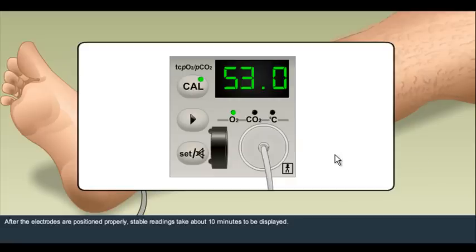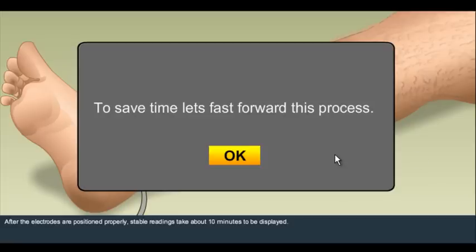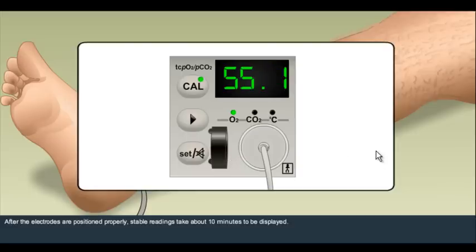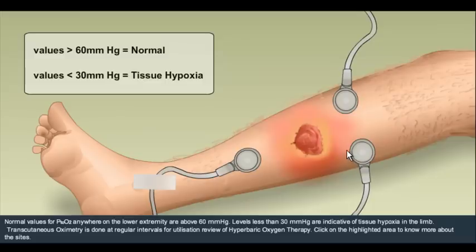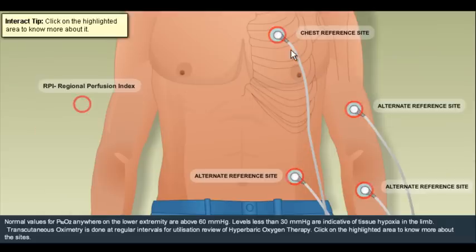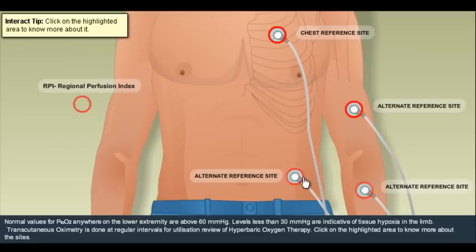See how the TECOM measurement is being taken. Learn more about the reference site that can be used for TECOM measurements.